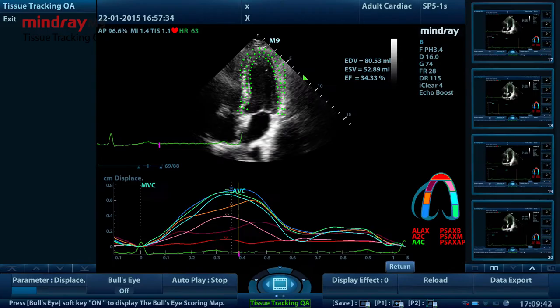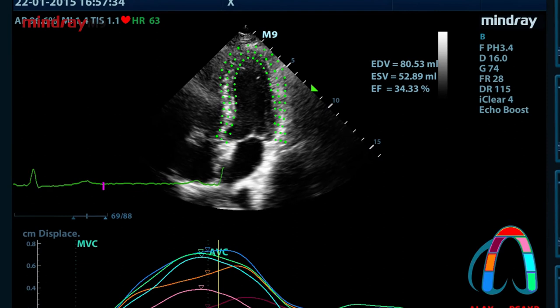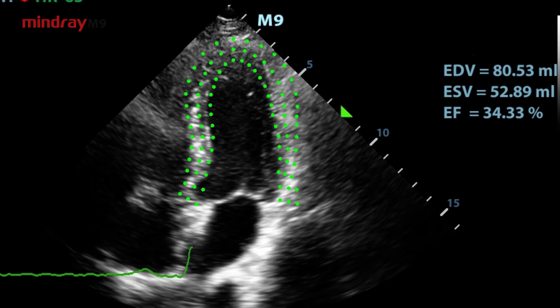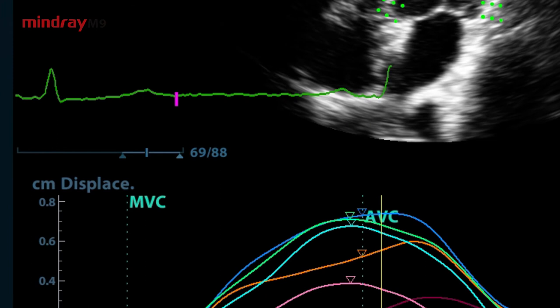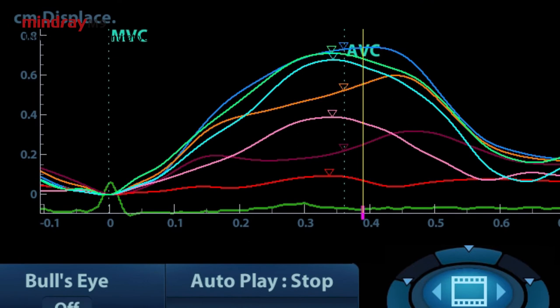Click edit on the soft menu to display the cursor. Roll the trackball and press set to reselect the trace reference points — inner dots of the curve. Move the cursor to the exact boundary position and press set again to set the right place. Click start tracking to start tracking again.